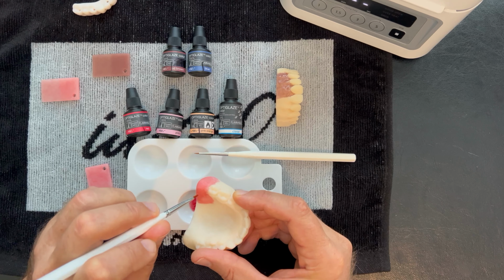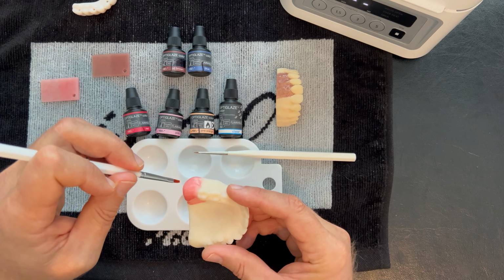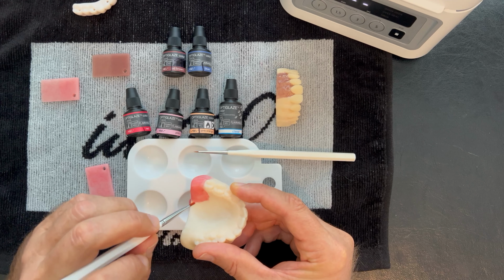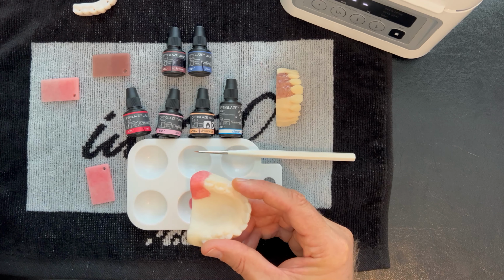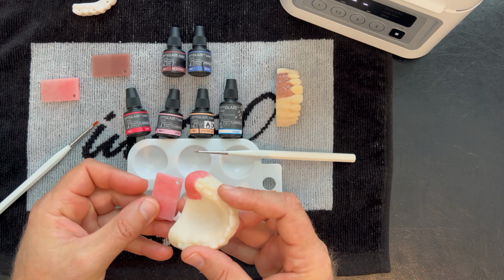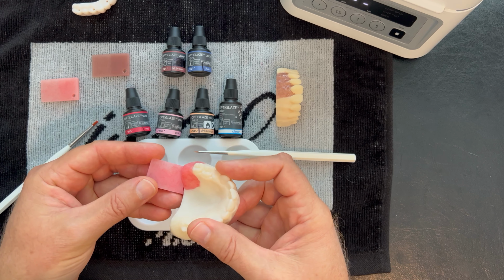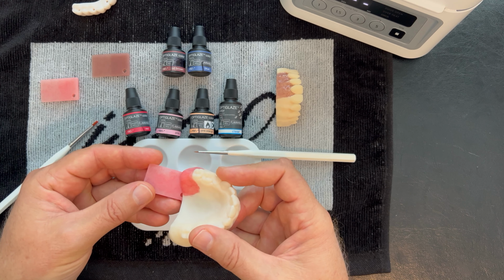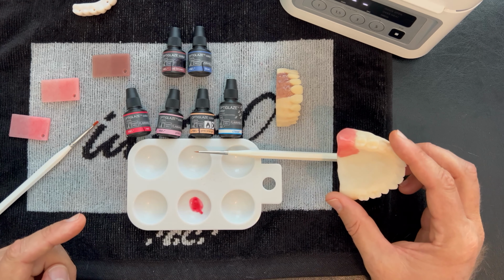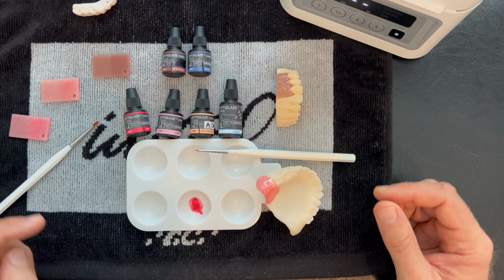The other thing I can do is I can come in here and kind of punch and twist my brush. It creates a little bit of irregularity that from a distance almost looks like fibers in the material. It's just creating little concentrated areas. Now at this point you can see we're pretty well there, okay? So I would tack cure this again, then I will put my appropriate clear on that I like to use, which is just the regular clear because it's thin. And then I would cure that in the Labolite Duo for 90 seconds.